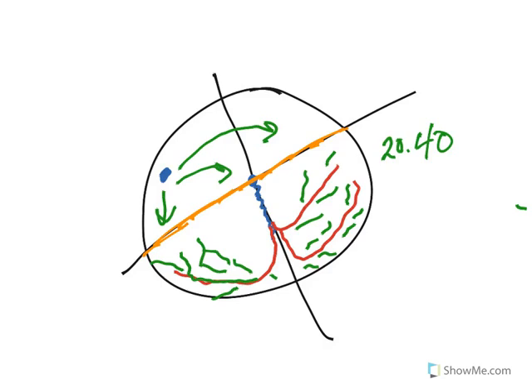So what you see is, if you count out the P waves, you'll get somewhere in that 60 to 100 range. And if you count the QRSs, you'll get somewhere in that 20 to 40 range, right?